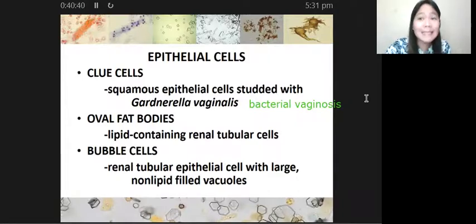Wala. Kasi, ang epithelial cell na nandun ay squamous lang. Kaya nga 'di ba, diniscuss ko yung origin ng ating mga epithelial cells. Para mas maintindihan natin, para ma-correlate natin yung kanilang mga variations or modifications. Nakuha? Bacterial vaginosis yan, class, 'di ba?